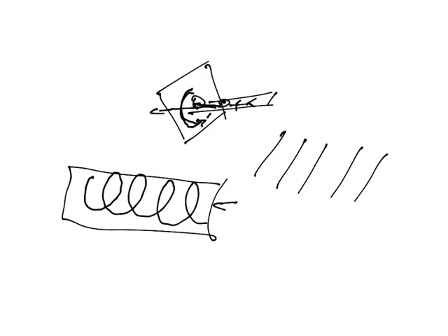Very powerful. And now we have a means of imaging the body inside and out in 3 dimensions, creating a model on the computer that you can rotate around, zoom in, look at different parts of the body, what's behind this organ, what's in front of that organ, all that stuff, purely from the power of, number 1, X-rays, but number 2, mathematics and computational power. That's what computerized axial tomography, CAT scans, are all about.